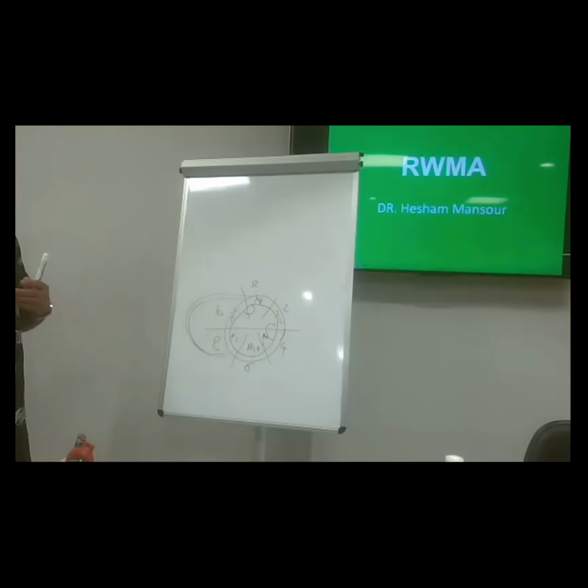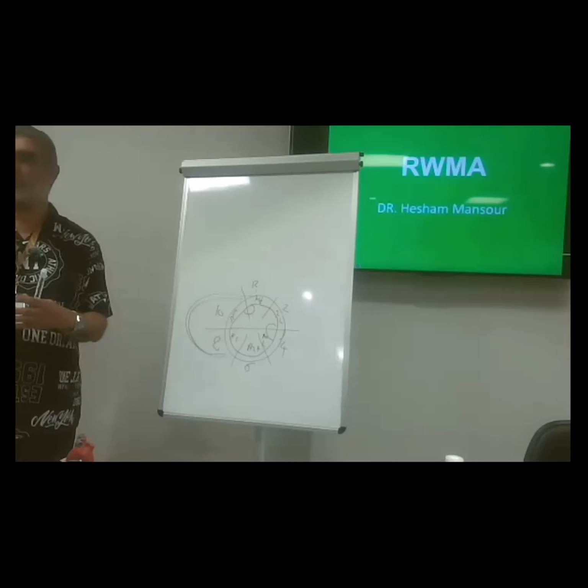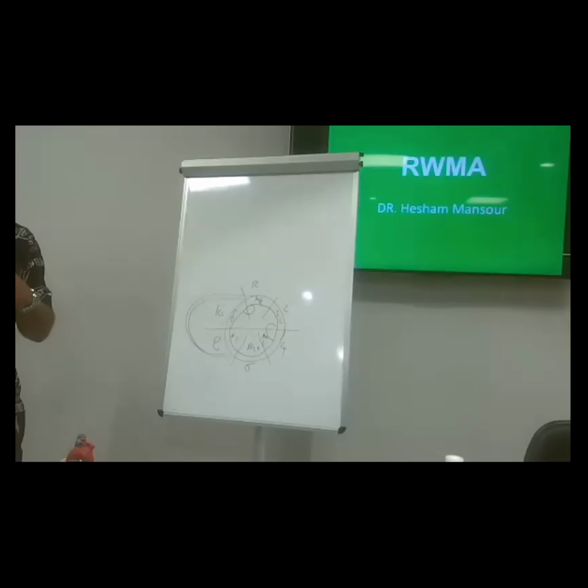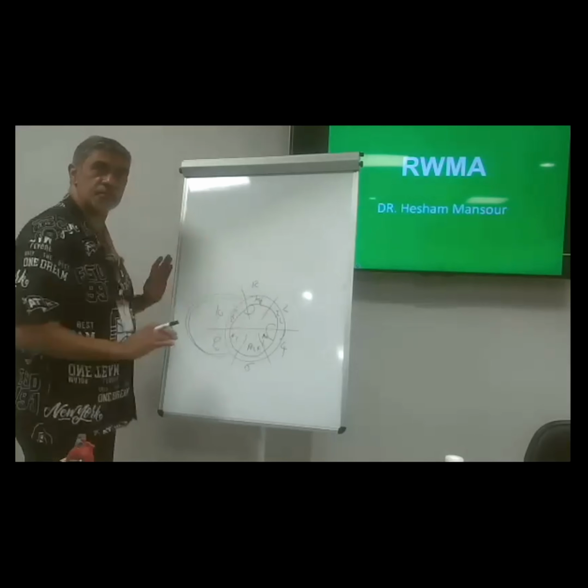You may be at the start confused with the names. I was yesterday with one of the colleagues. I asked him, what is this? He was very confused. So 12, 2, 4, 6, 8, 10. This is nice, okay?